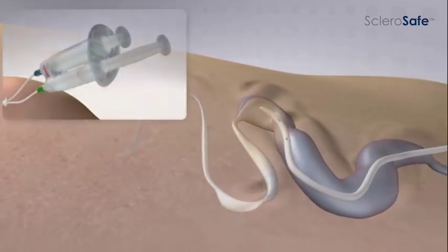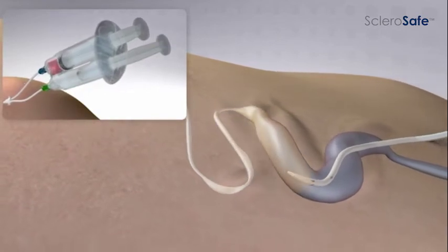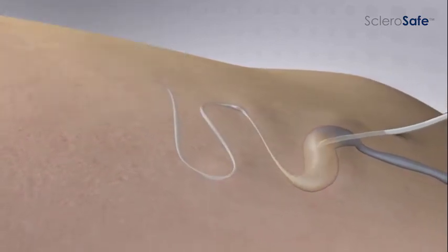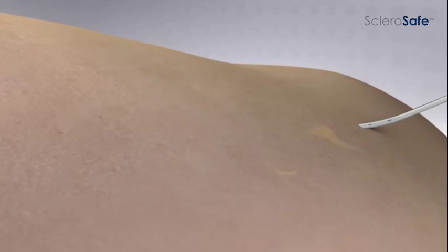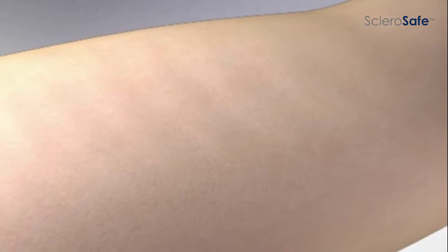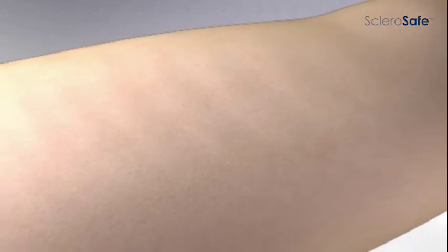The blood aspiration results in negative pressure which stabilizes the sclerosant and prevents upflow of sclerosant within the treated vein. There is minimal dilution of sclerosant with blood, no trapped blood clots, and no inflammation or skin discoloration.